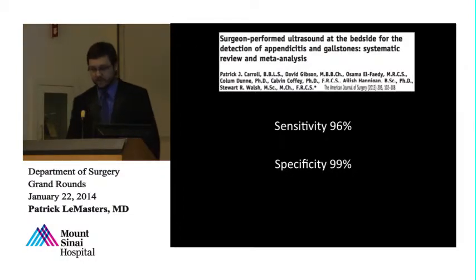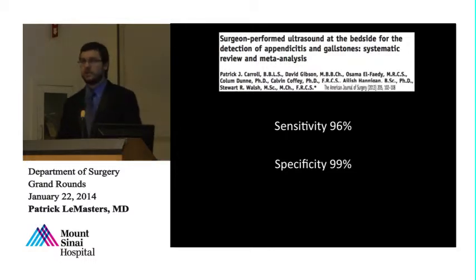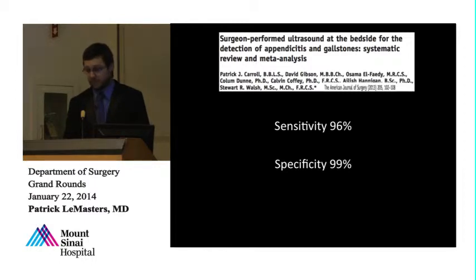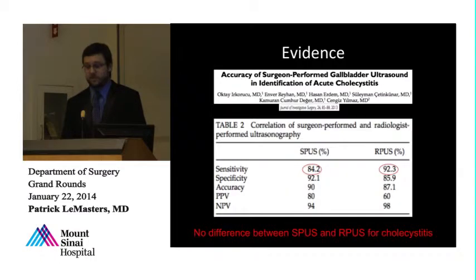So to answer the first question, stones or no stones, are surgeons good at being able to identify stones? In this meta-analysis looking at over 1,019 patients, surgeon-performed ultrasound had a 96% sensitivity for identifying gallstones and a specificity of 99%.